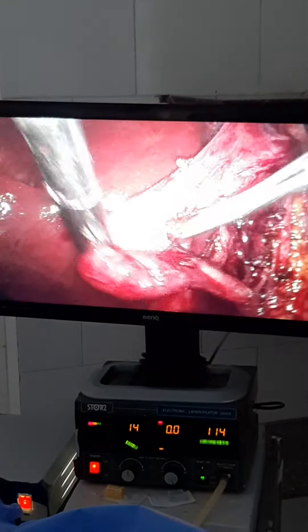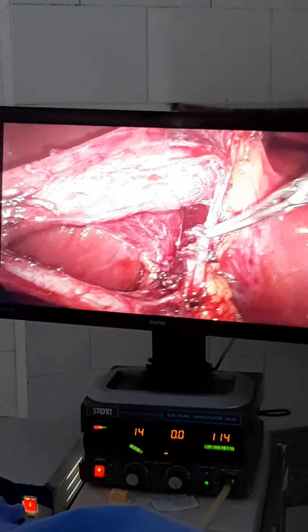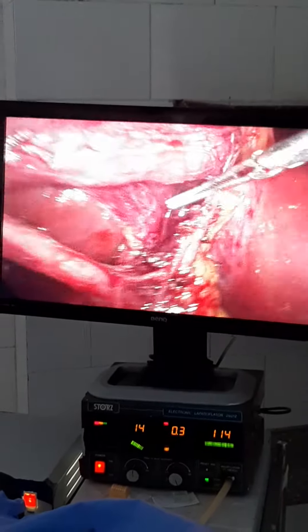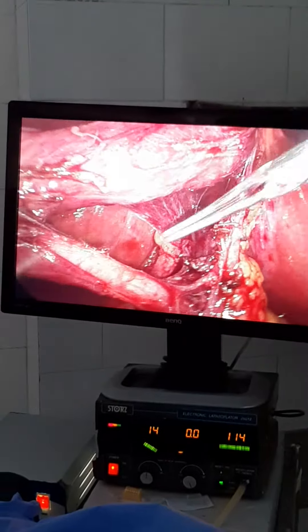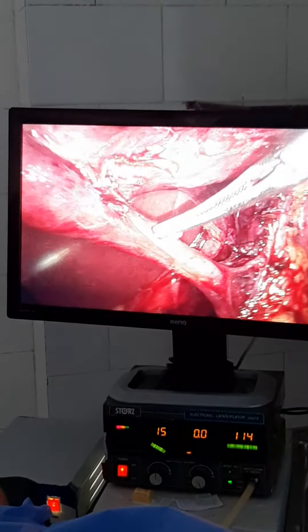Here we can see Hartmann's pouch. Here we have dissected the Calot's triangle — this is the cystic artery. In these cases, I have to dissect the whole length of the cystic duct to avoid an aberrant right hepatic duct joining the cystic duct.